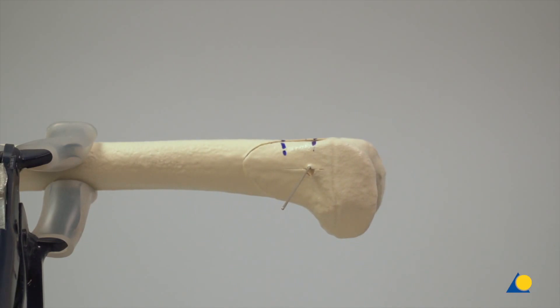The size of the wedge determines if a second screw is necessary. In this exercise, the metaphyseal wedge is large enough so that a second screw is recommended in order to secure the fragment.